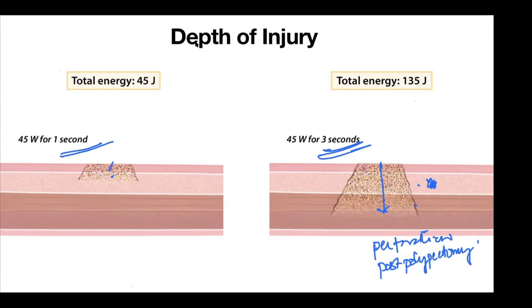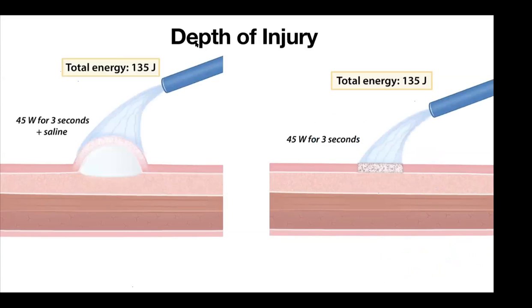That means the patient comes back with pain and maybe they can have fever, but if you do CT, they may just have a little bit of fluid, but no perforation. So it's very important to not keep the probe at one point and keep buzzing at one point where you char that area. That means that area below is going to develop a perforation.